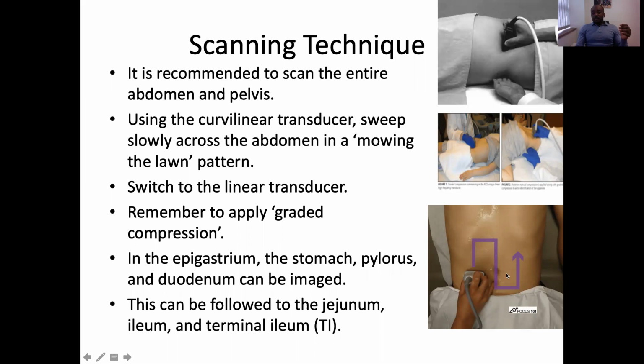And while scanning, remember to apply graded compression. You can use this technique to the top right corner of the screen here. Apply a bit of pressure on the patient's back and just press slowly but firmly while scanning. That technique helps to eradicate bowel gas, and it helps to bring the bowel closer to the transducer, which in turn gives you higher quality imaging feedback, which would help with diagnosis.